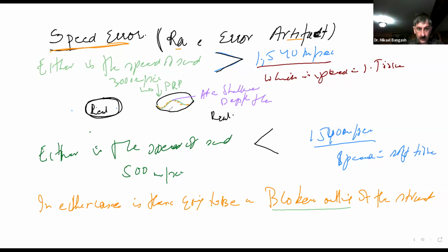Although physically the sound traveled down here, mainly because it was a faster speed, the system gets the impression, because this reflects back at a shorter time, that you have a shorter go and return time. That's how the system may wrongly perceive it as coming back from a shallower depth. Did that make sense?